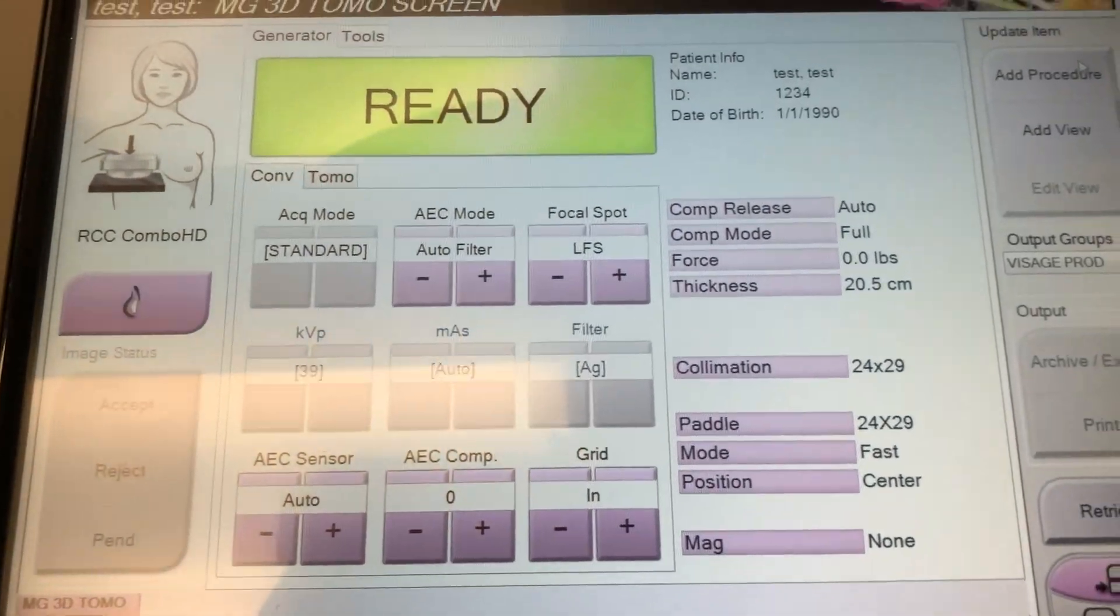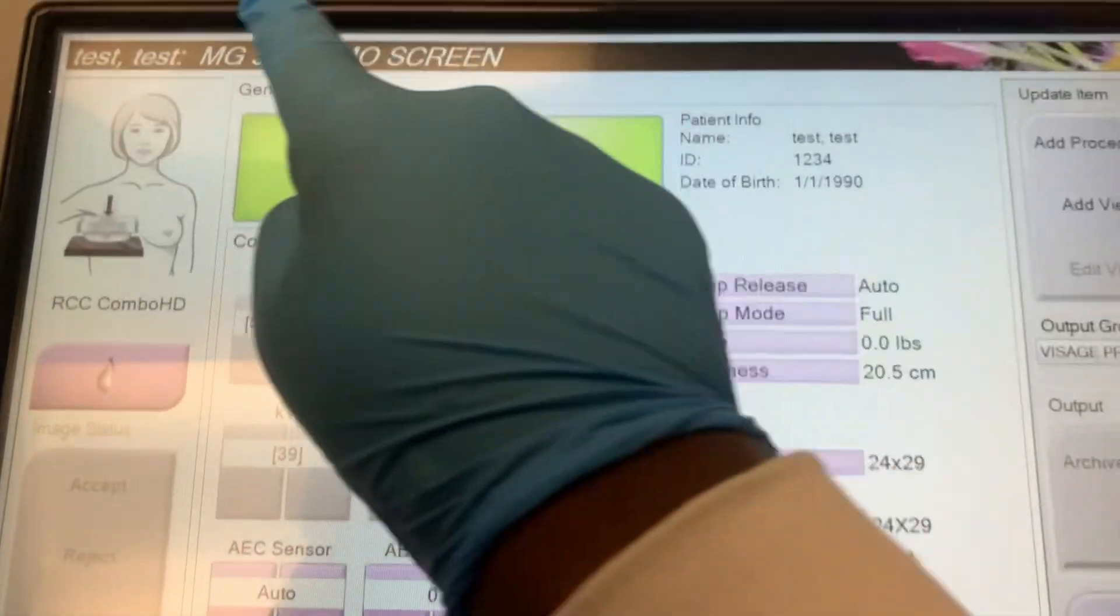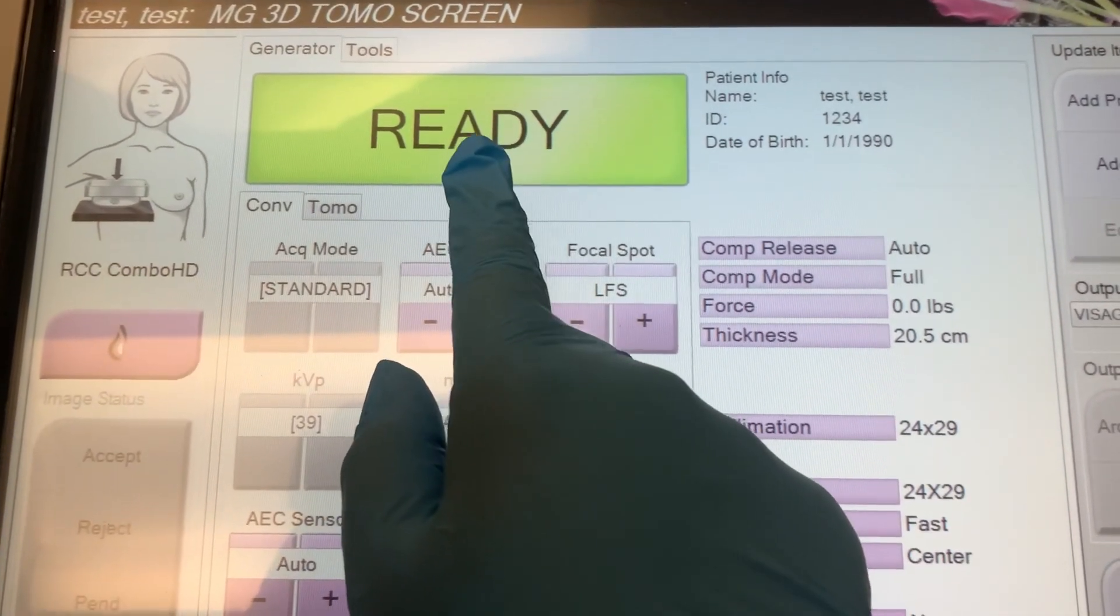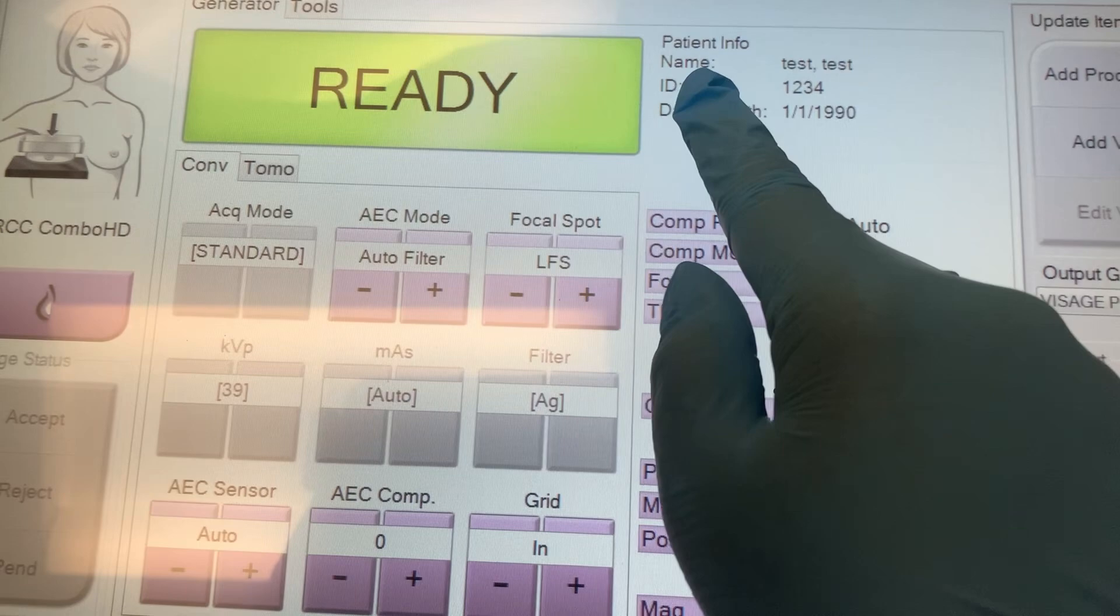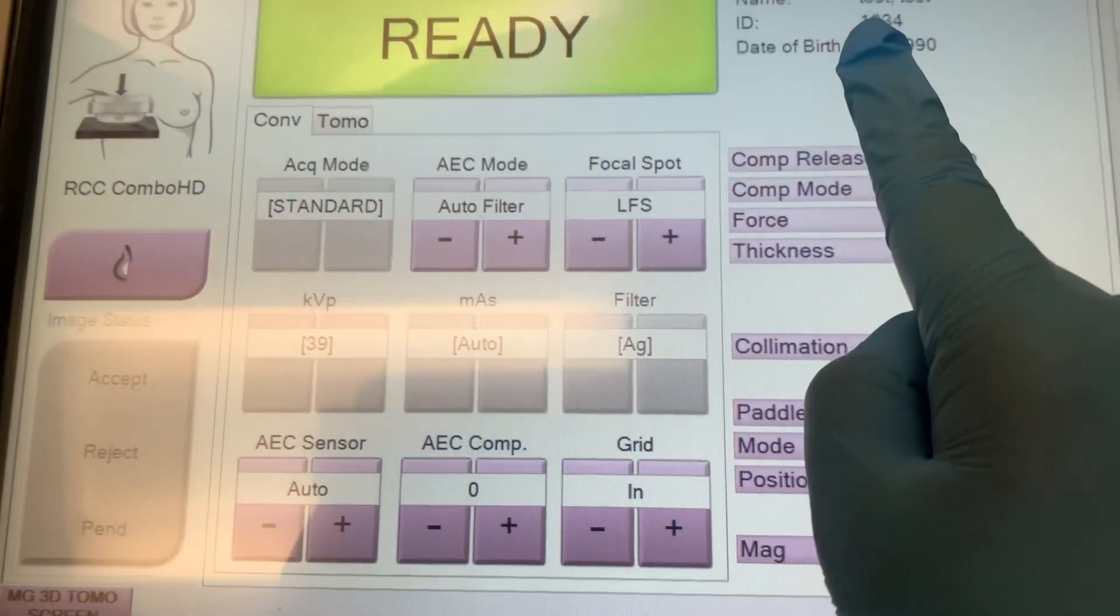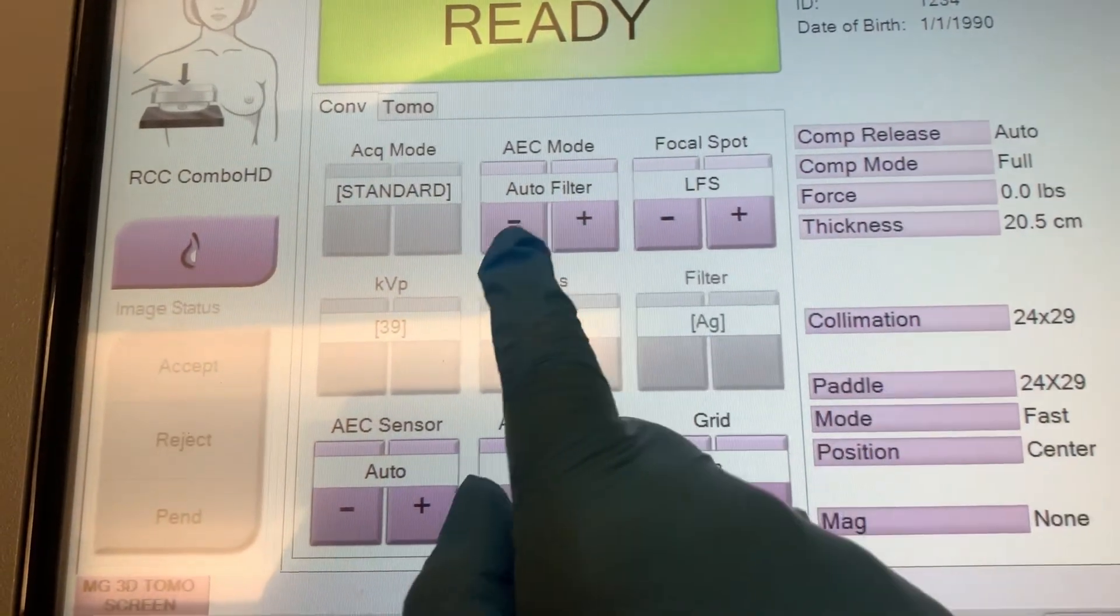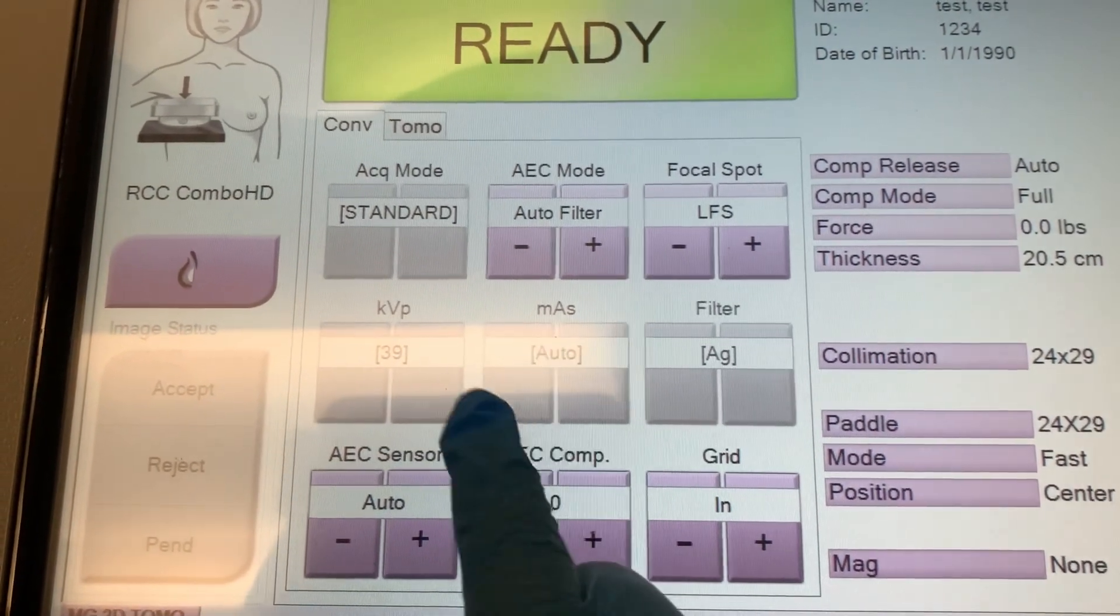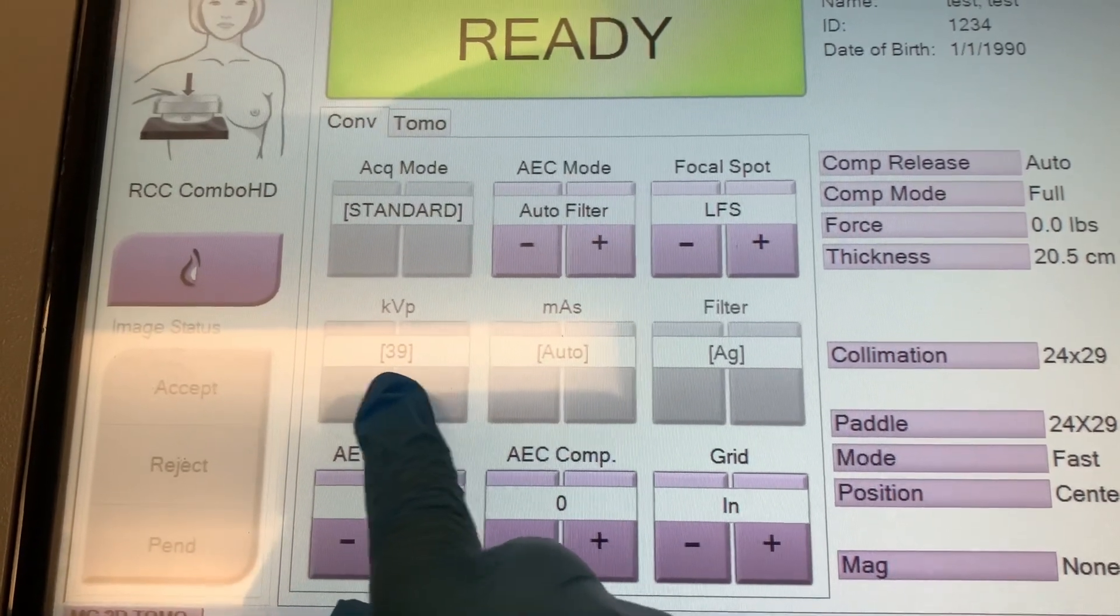All right, so this is how the actual machine will look. Right here, it will show what the patient's having done. It will let you know when you're ready. And then the patient's information, like their name, patient ID number, date of birth will be right here. So make sure this is correct. And then right here, this is what I was telling you all. How you see the KVP, it's at 39.